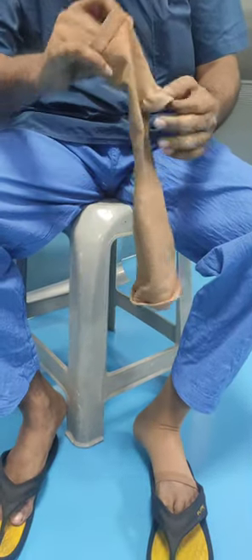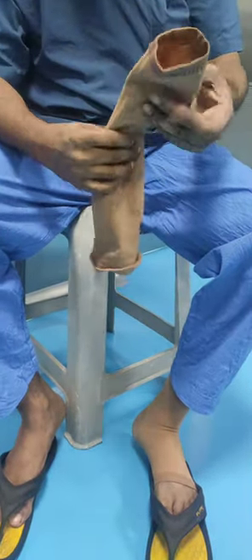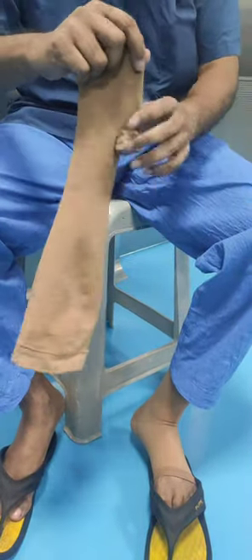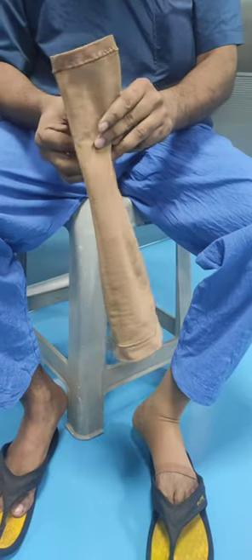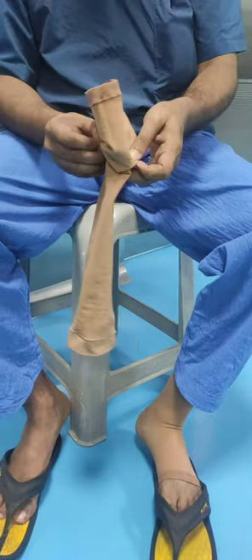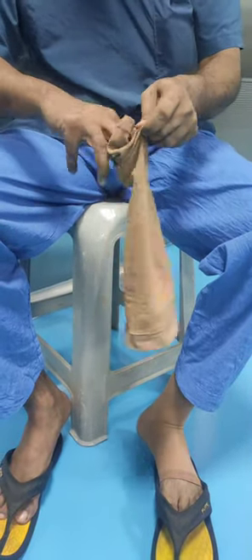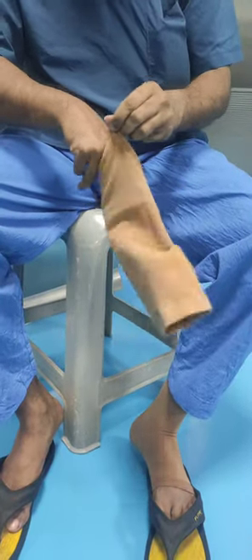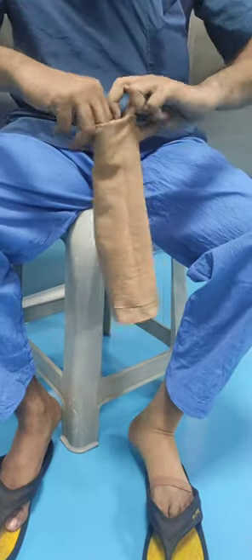Again hold in upright position with the foot end side up. Then at the level of the heel sack, hold the fold and put the foot end side into the stocking up to the level of the heel sack.